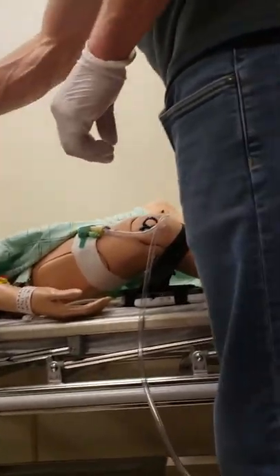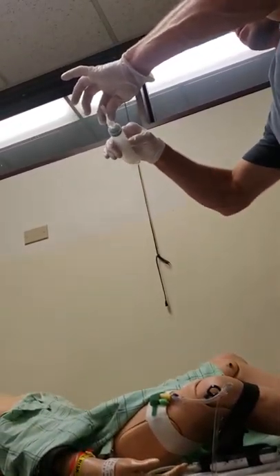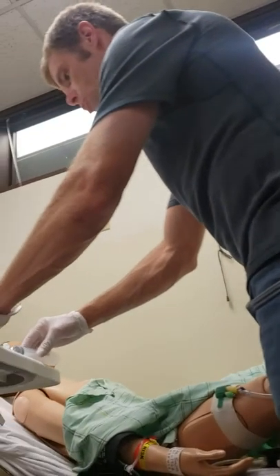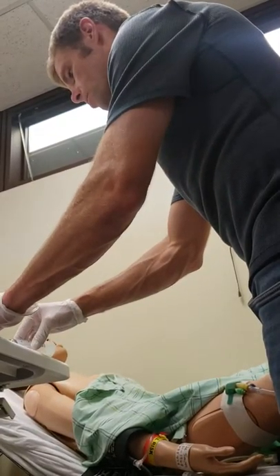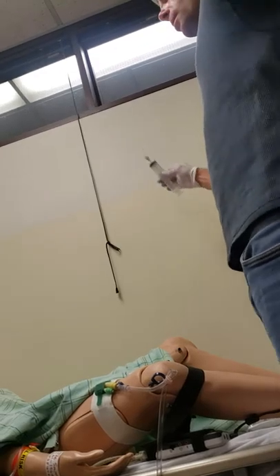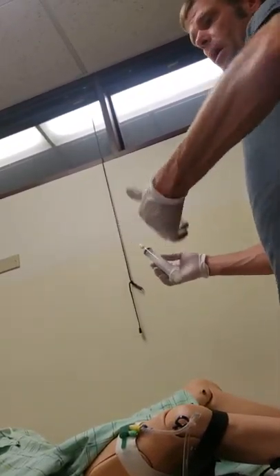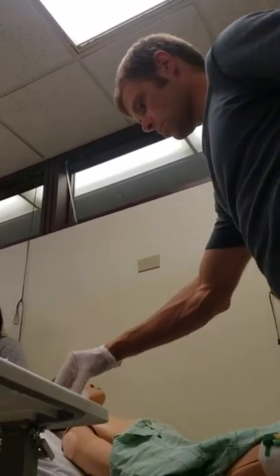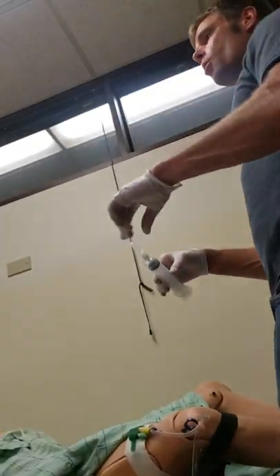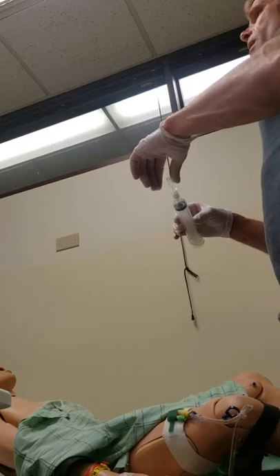Let me show you guys something, because this is what you do. You don't want to make a big motion — you want to get the cap off ever so gingerly, and you take it off. And then you don't recap a used needle. I can recap this needle all day long because it's not used. If I forgot something, I don't recap the needle — not a problem. But once it goes inside the patient or I inject the patient, it never gets recapped. Never recap a used needle.